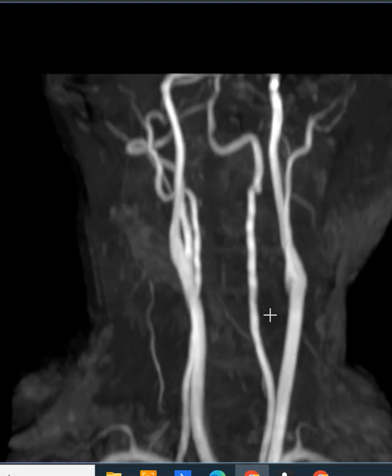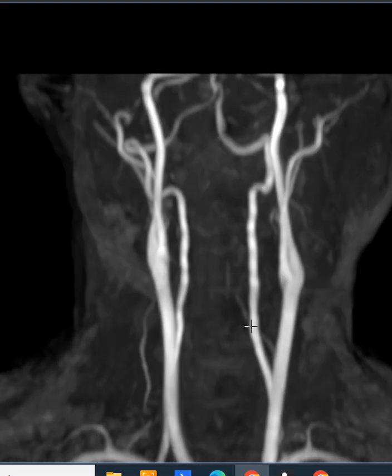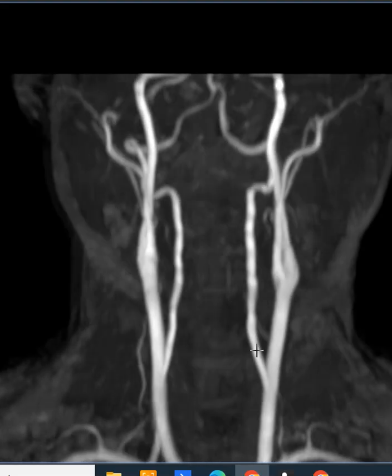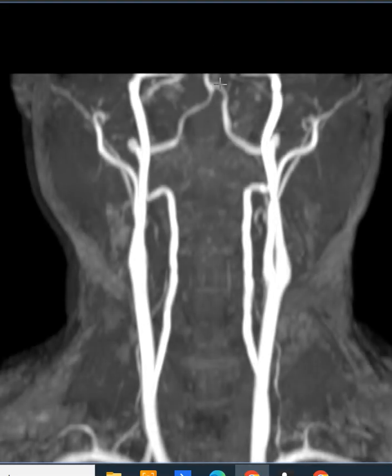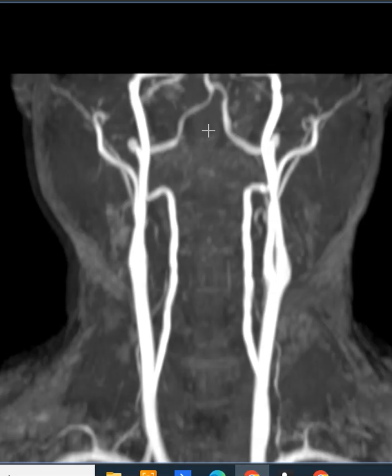We look at the blood vessels of the neck here in this patient. This is the left vertebral artery, right vertebral artery. They come up, loop out, and come back together to form this common artery here called the basilar artery that goes up to the back of the brain.